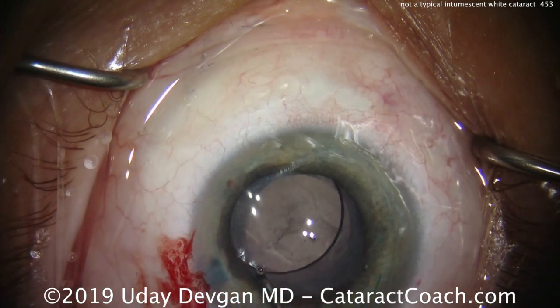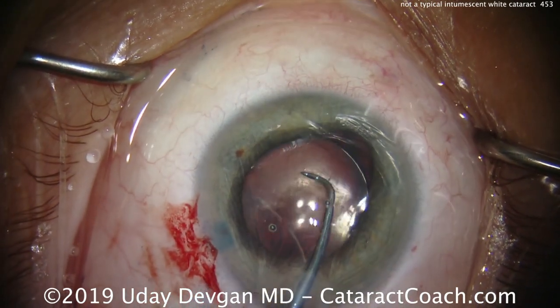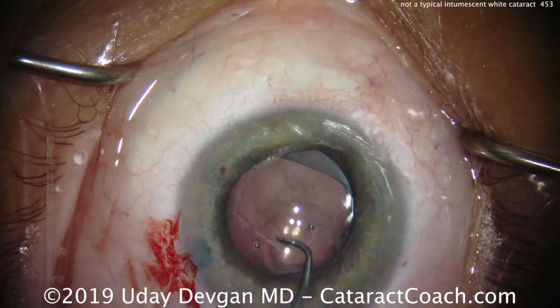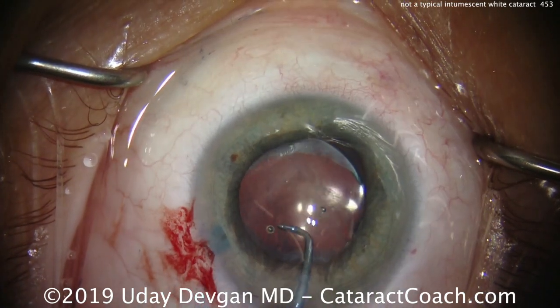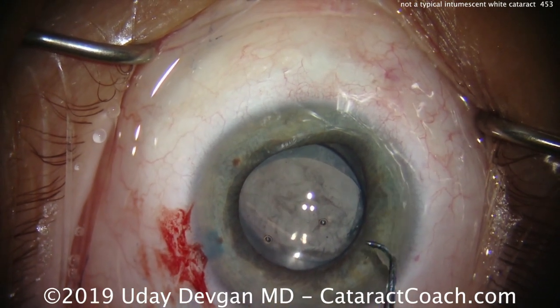0 to 9 diopter IOL, no adjustment. 9 to 18, drop by half diopter. 18 to 27, drop by 1 diopter. And so there you go, there's the optic capture, and this will be very good for long-term stability.